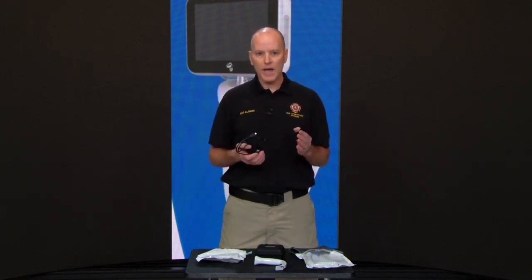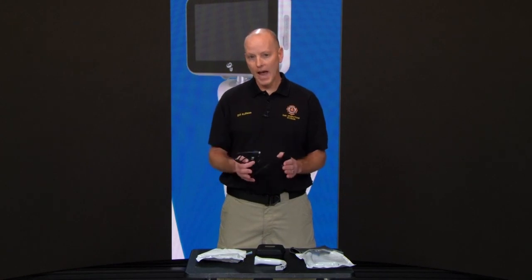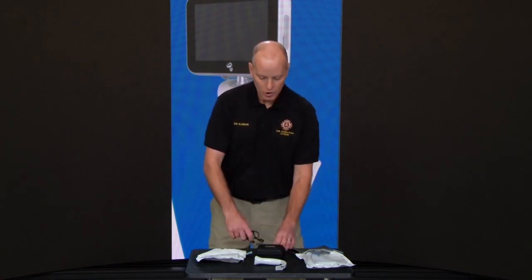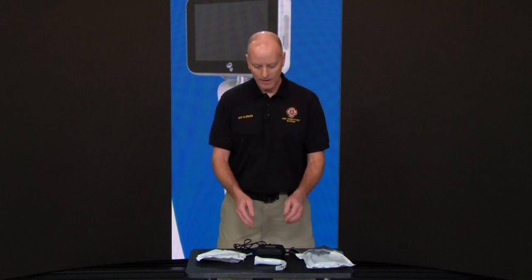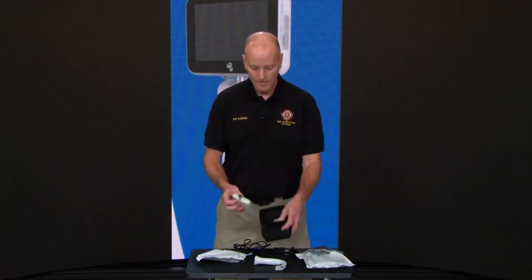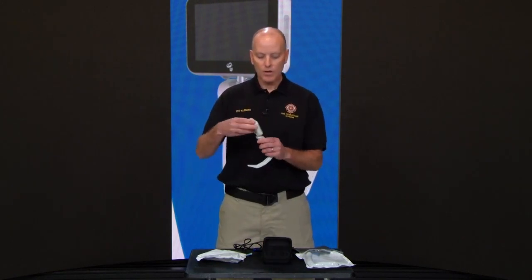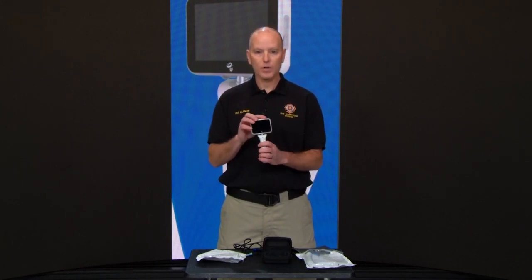Remember, every Tuesday or whenever your weekly is on that, I would go and charge this up. Remember, it's 200 minutes time, but from 0 to full charge is a full 3 hours. So make sure you charge that up at least once weekly. When you're taking your UE scope out, it's got to be attached to the blade before you turn it on.